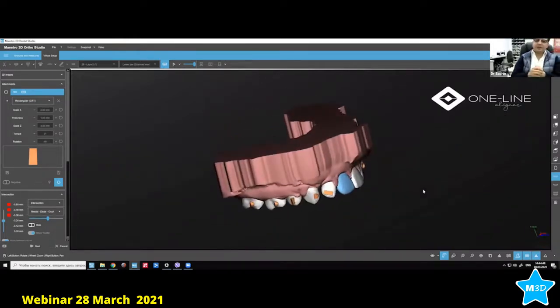Why? Because for any movement, if you want to move this, right? If you are down and you have something which is going to press, it's going to be both ways, from here and from here. So the upper and the lower from here, because it is placed inside on the tooth. So this is also workable for smaller teeth. Why? The yin yang attachment, the double attachment, they are pretty small. They don't give you all the time the movement that you need. But this attachment being bigger and thicker, it will give you the downward movement and the upper movement together.